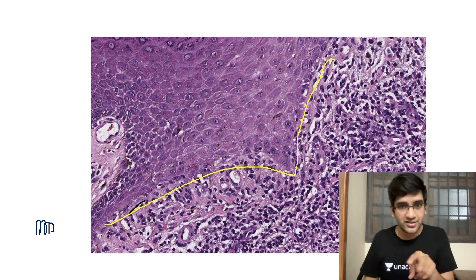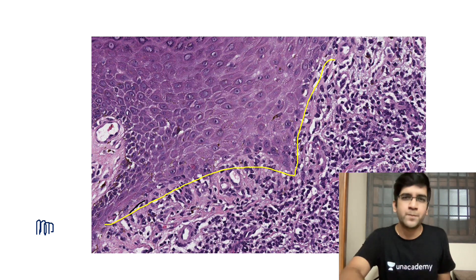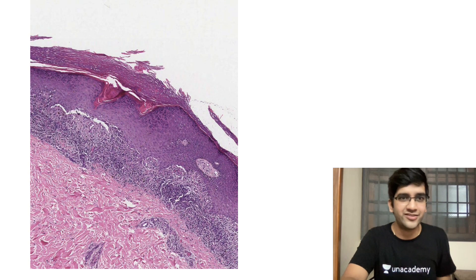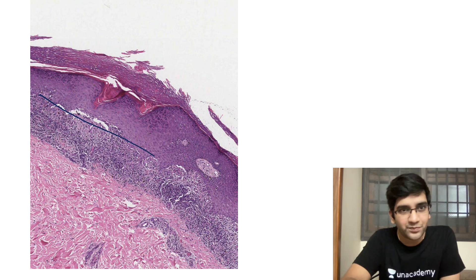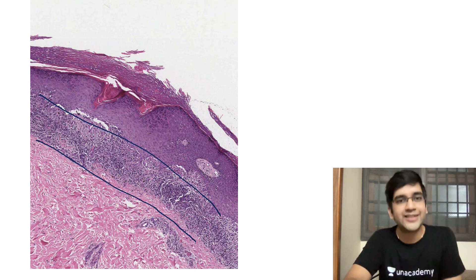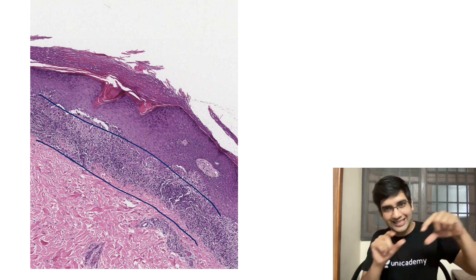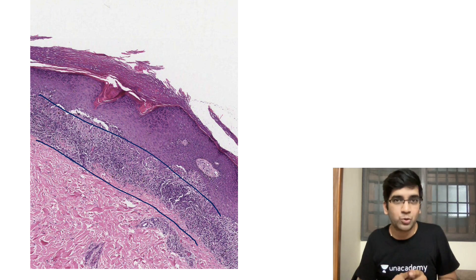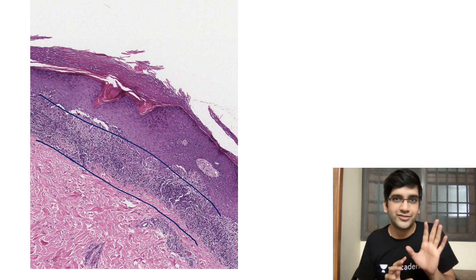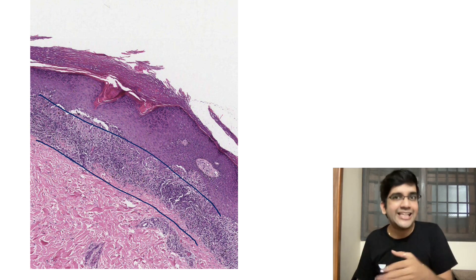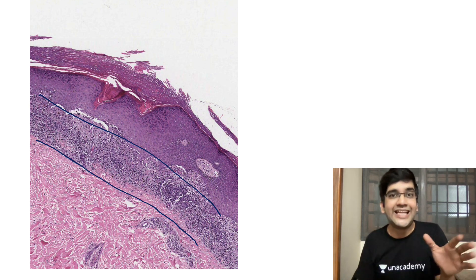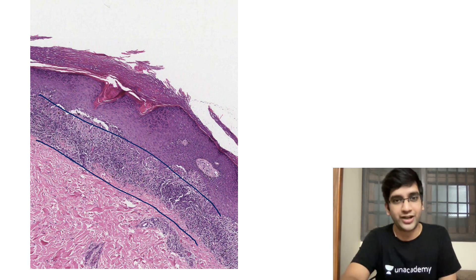Second finding: I have a classical inflammation here — those are all lymphocytes. It's a very low power image, but I can see the classical inflammation in the skin biopsy. A band-like inflammatory lymphocytic infiltrate — if I'm allowed to say that, it should have given you the diagnosis.